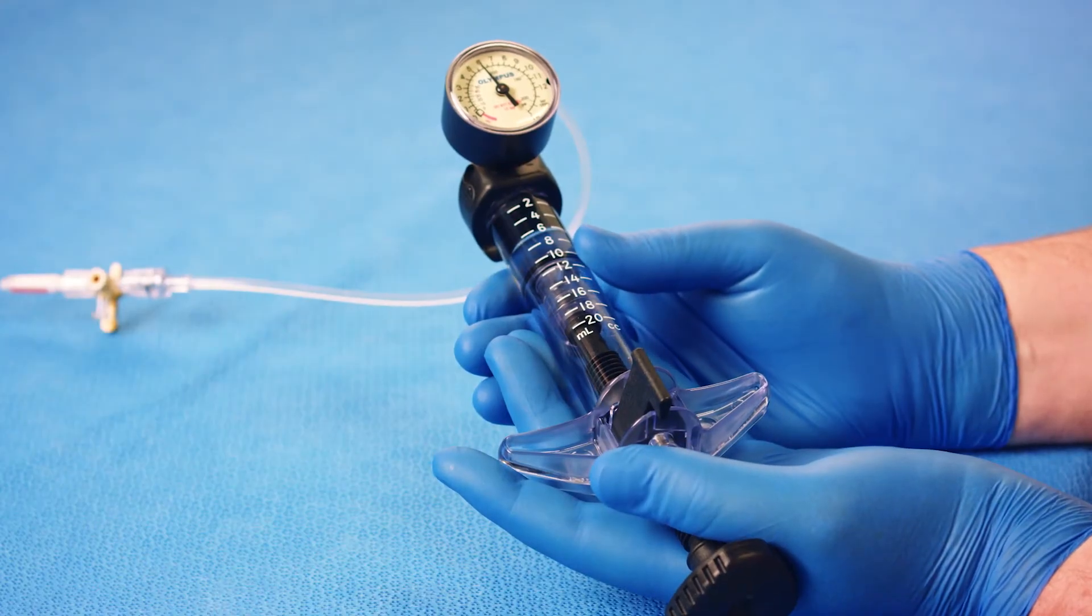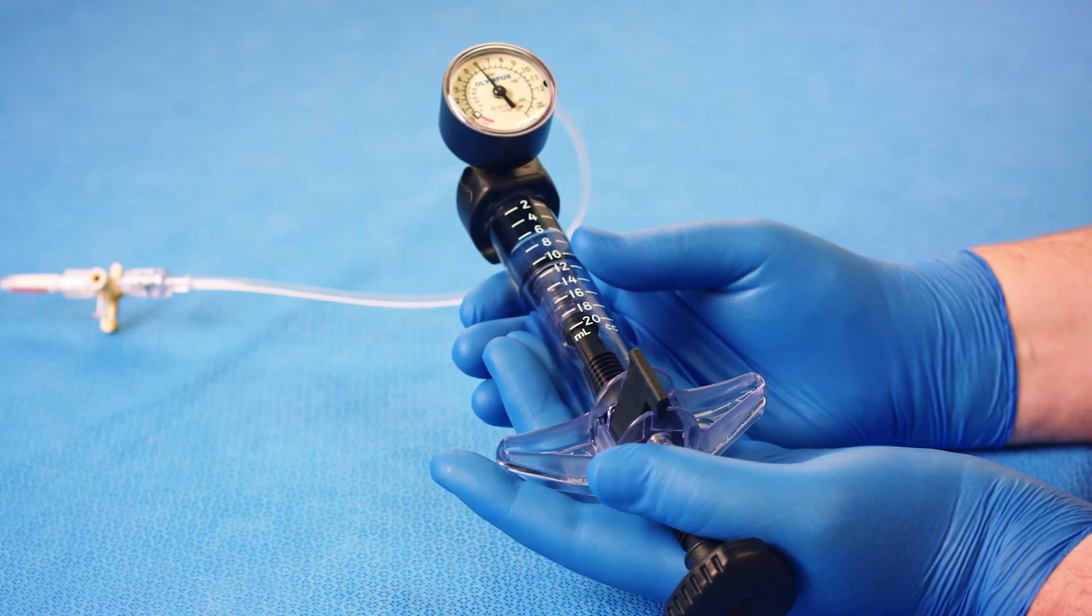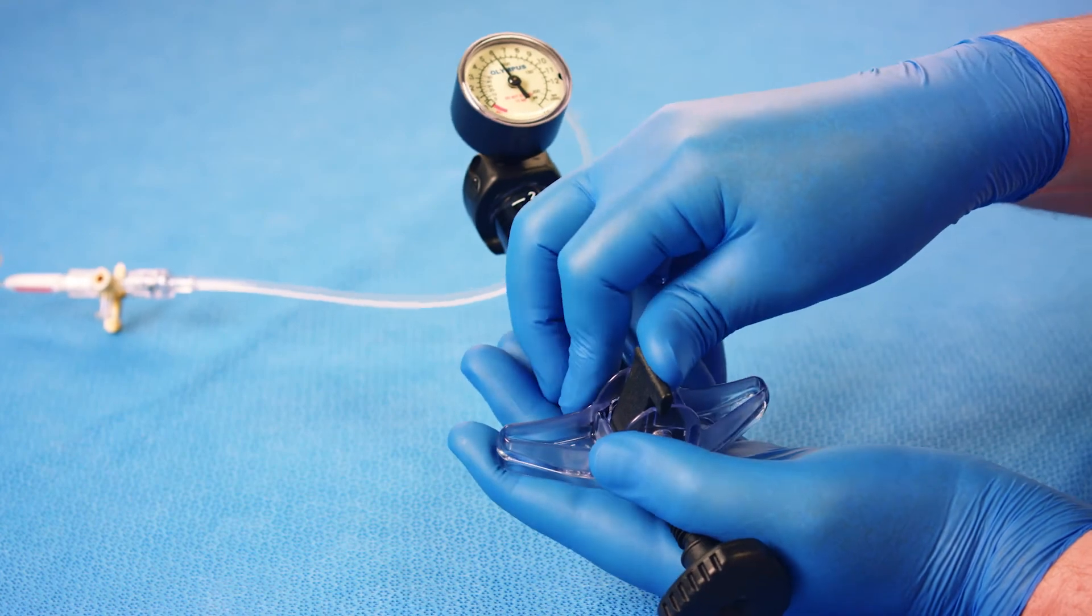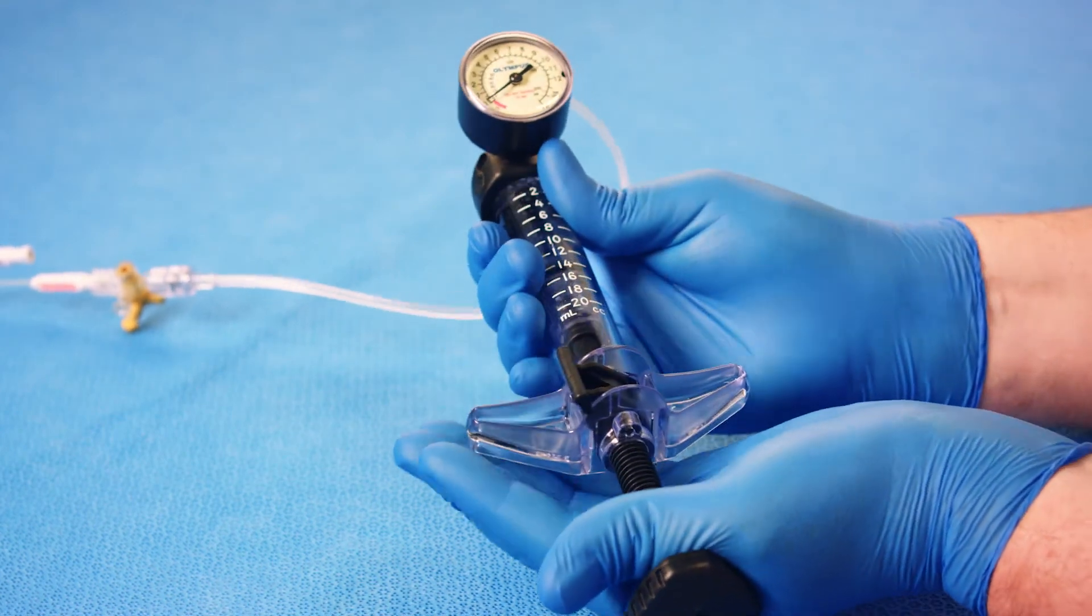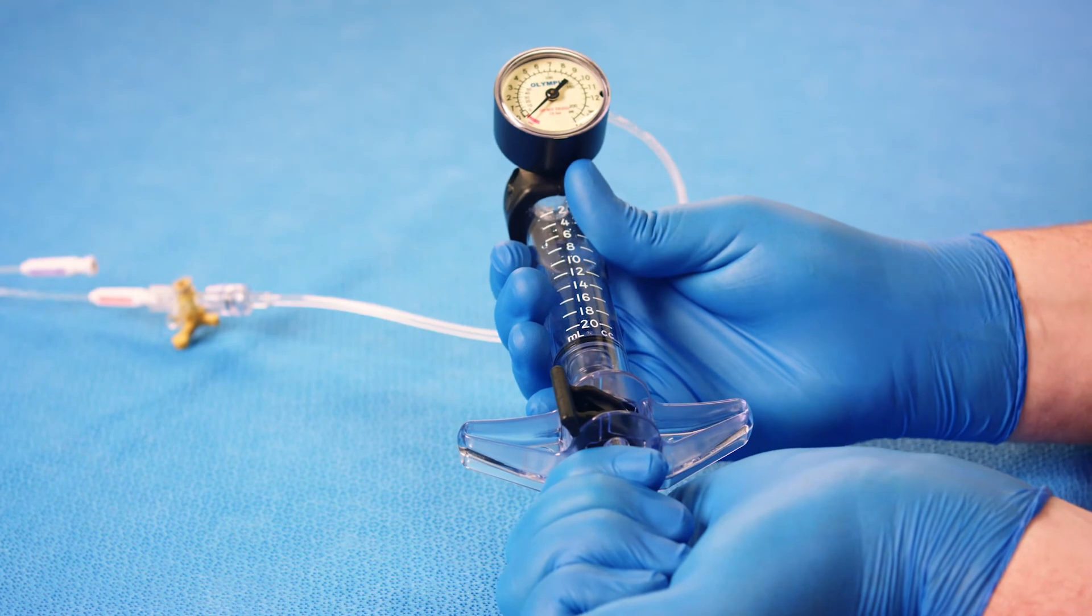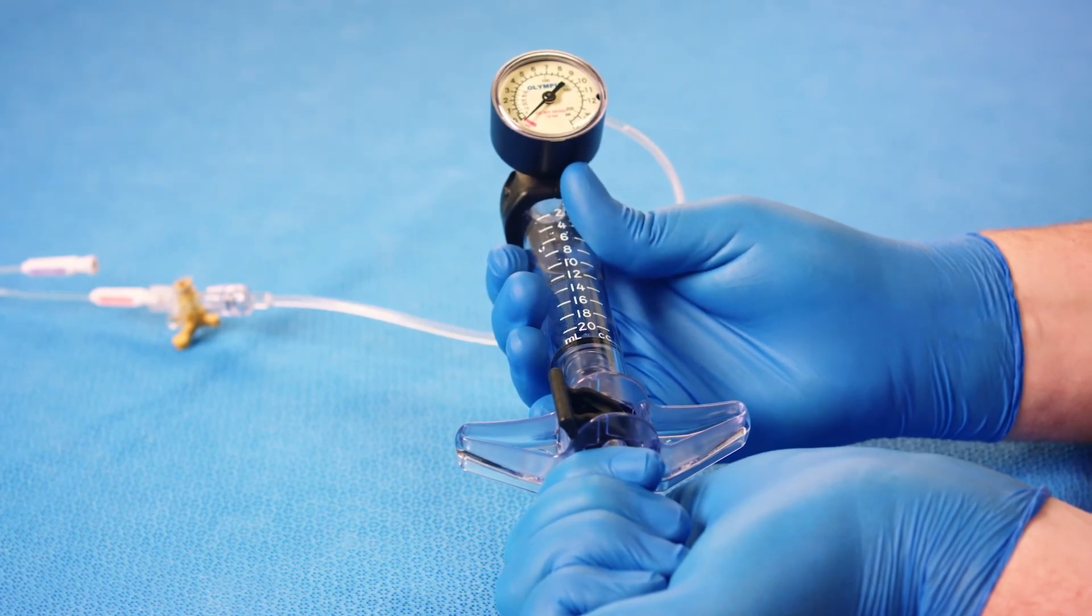Once dilation is complete, turn the locking switch back to the left position. Pull the plunger all of the way back, resting the end of the plunger against the side of your hand as shown here.